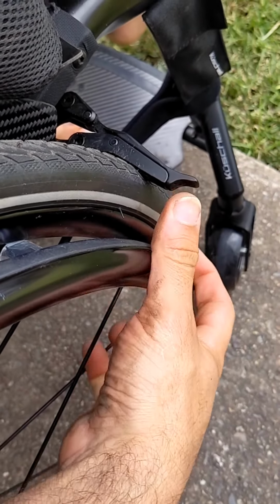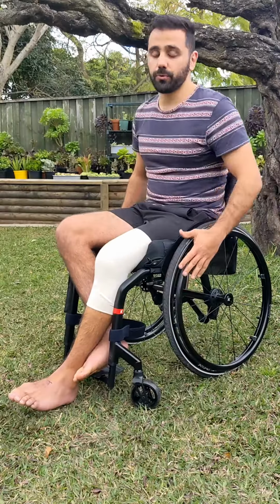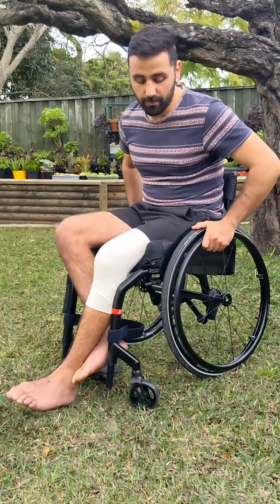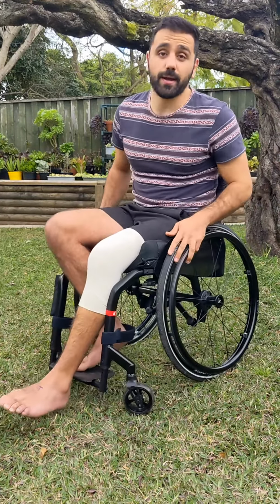The reason why they're really good is not only because they're lightweight, which they are, but they also get pretty far out of the way when you're going to push. So when you're doing your propulsion, even if you stick your thumbs out a bit, they're not going to clip onto the hardware. The other brakes I'll talk about are push-to-lock brakes.